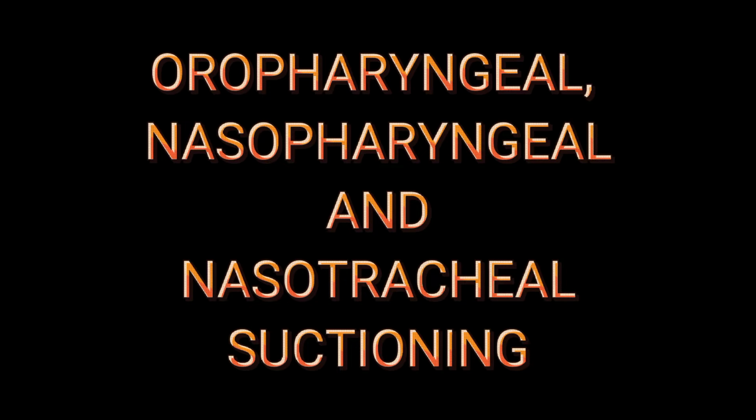Oropharyngeal, nasopharyngeal, and nasotracheal suctioning. The purpose of this is to remove secretions that obstruct the airway and also to obtain secretions for diagnostic purposes. Suctioning is also done to clear secretions and mucus from the throat if the client is unable to cough them up or swallow.